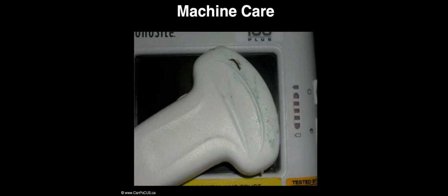Machine care. Infection prevention and control is extremely important. Ultrasound machines, in particular transducers, can easily act as a vector for fomites and be responsible for cross-contamination and transmission of infection. The transducer should be wiped down before use, and then after use it should be thoroughly cleaned, removing all debris and all gel, and then disinfected with a wipe.